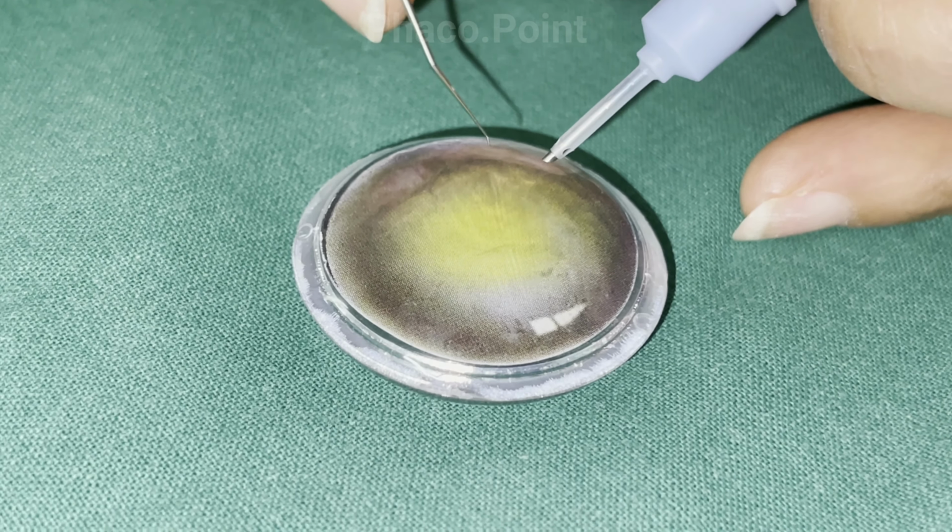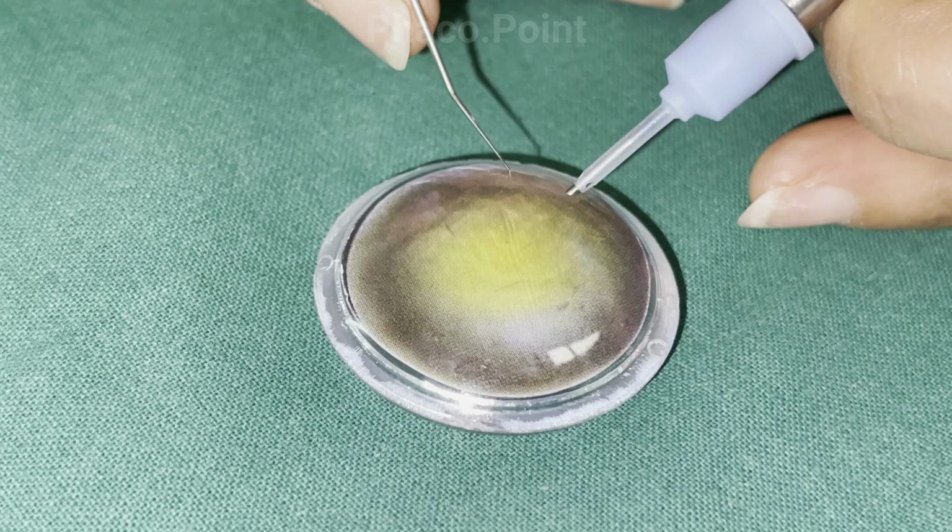Your foot pedal is currently in position 1. You move to foot pedal 2, which is aspiration, still no movement of the tip. And then you go to foot pedal 3, which is the onset of Phaco emulsification.